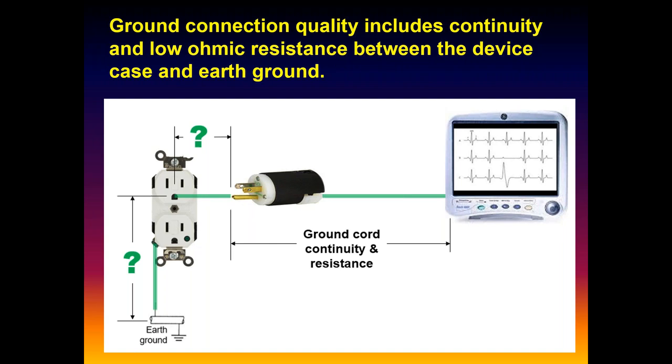So you've got a 10 amp device, a 1200 watt device, with a tenth of an ohm. 10 amps squared is 100, times 0.1, so you've got 10 watts being dissipated just at the plug-receptacle interface. It's warm. Same thing with the receptacle. If that ohmic resistance gets too large, it can be a problem.